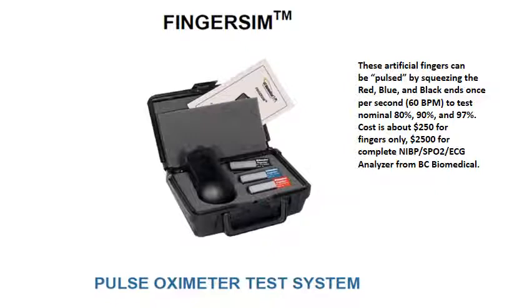And they can be used without the mechanical modulator, which is very expensive and mates with a non-invasive blood pressure simulator. These cost about $250 US, whereas the entire system costs about $2,500. However, you can purchase these, and if you actually just use your finger to pulse at about 1 per second, you can get most pulse oximeters to respond and give you a saturation value that is fairly repeatable on a given device and from device to device.